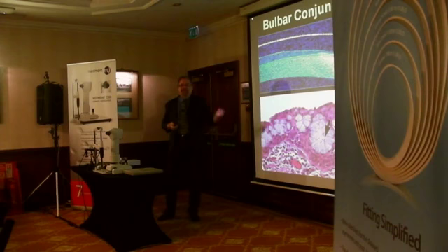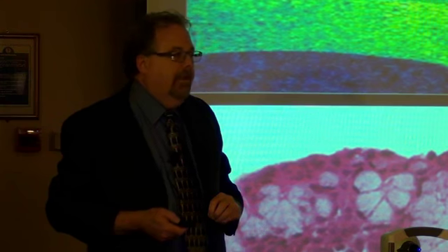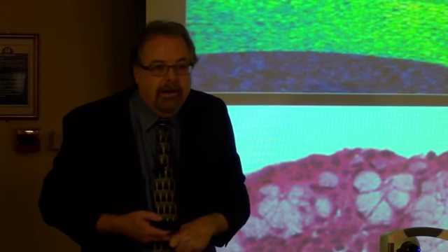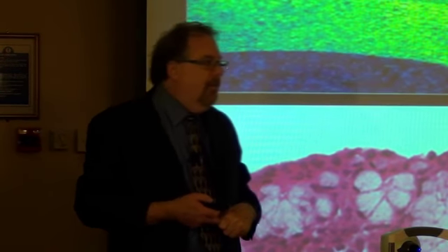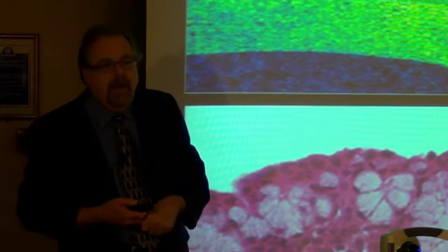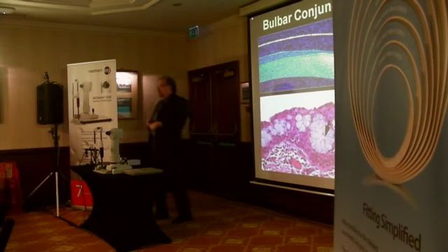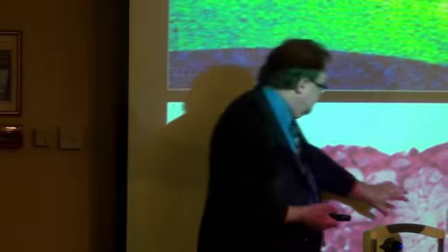You see, mistakenly, we call these scleral contact lenses. Well, they don't even come close to hitting the sclera. They're riding on the bulbar conjunctiva. Now, anatomically, the bulbar conjunctiva has a unique surface. It is loaded with these goblet cells.